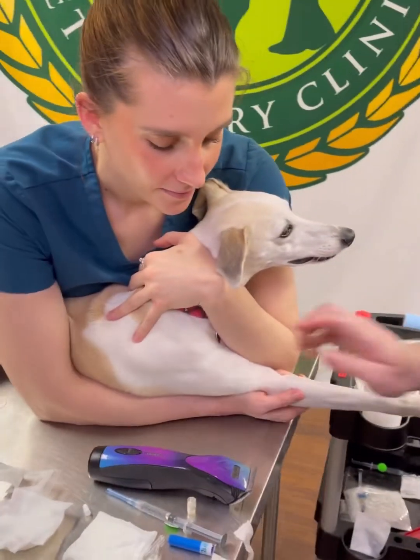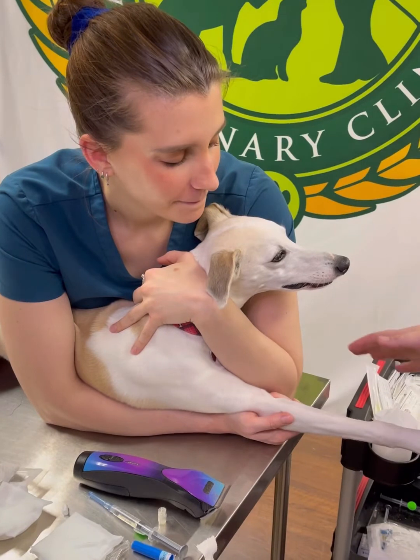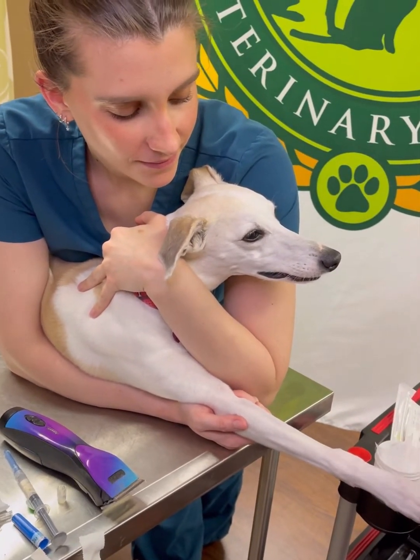Our assistant Madison here — this is a very important job — is the restrainer. She has a nice arm around the dog's neck and she's extending the elbow for me. The restrainer's job is very important.